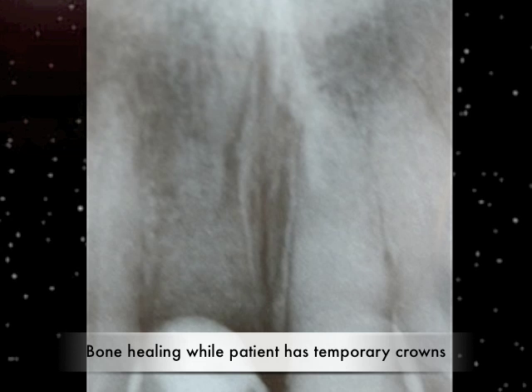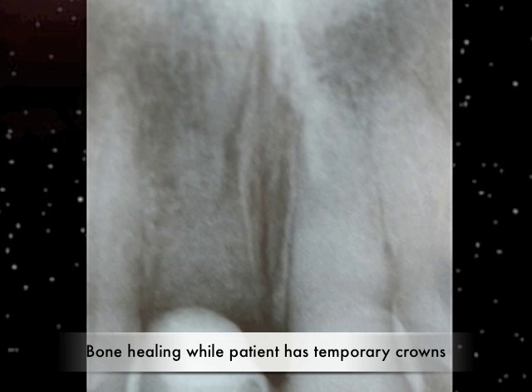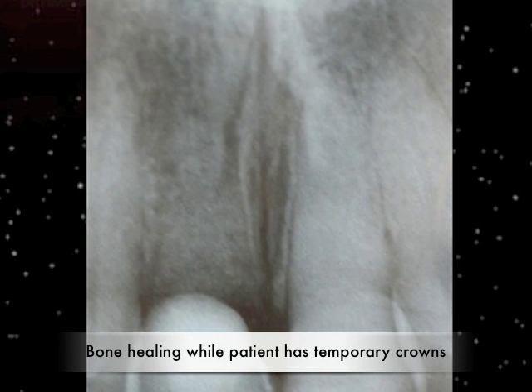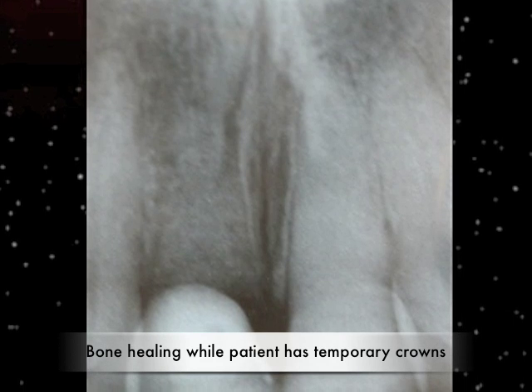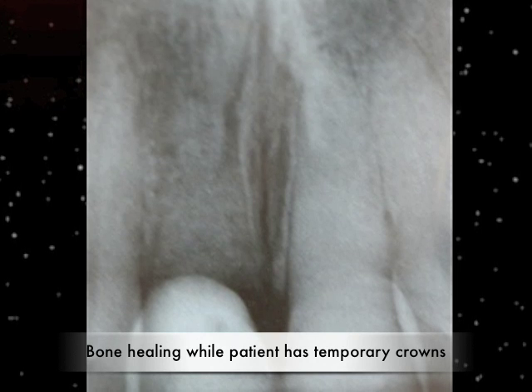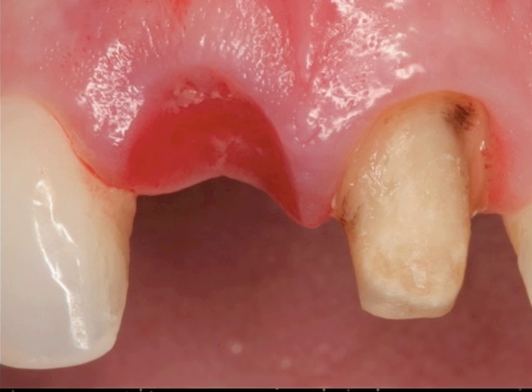One miracle at a time — put the bone in first and let it heal. We usually need several months of healing for the bone to mature and grow into your own bone to allow us to have a site for implant placement.